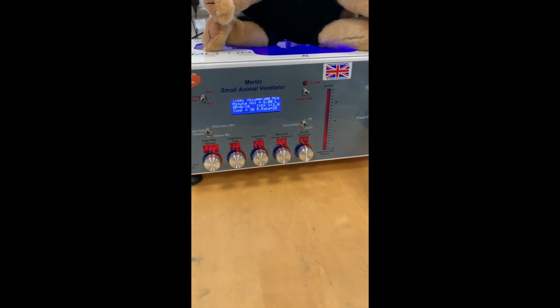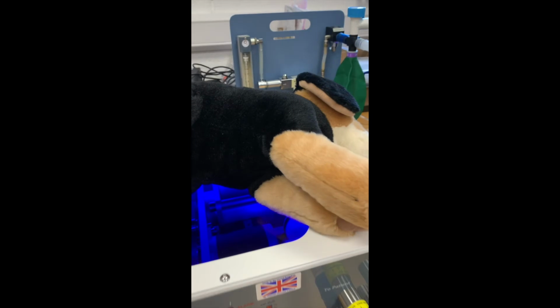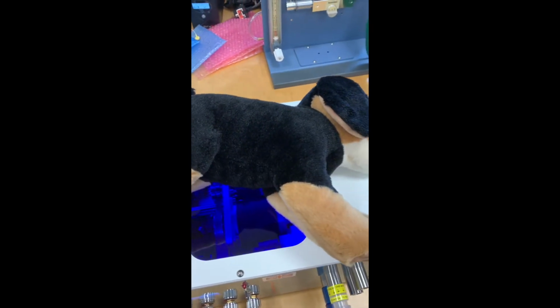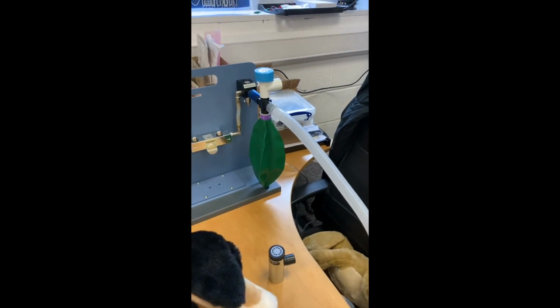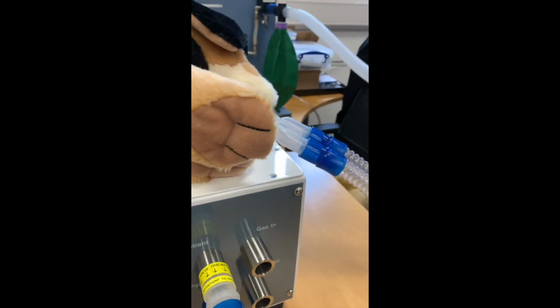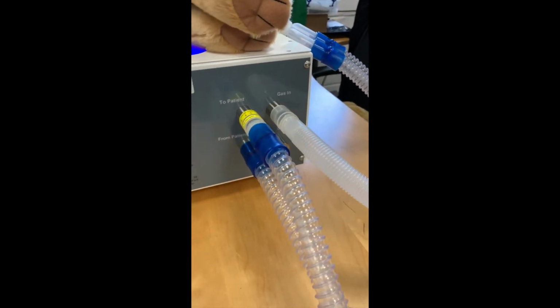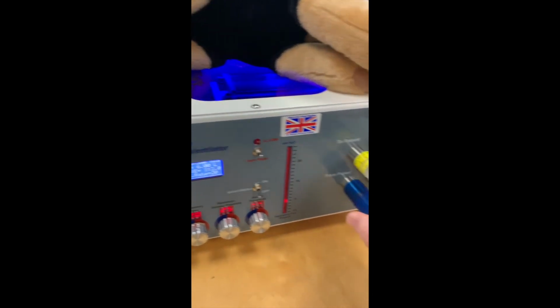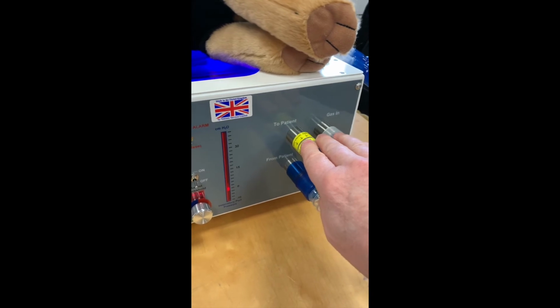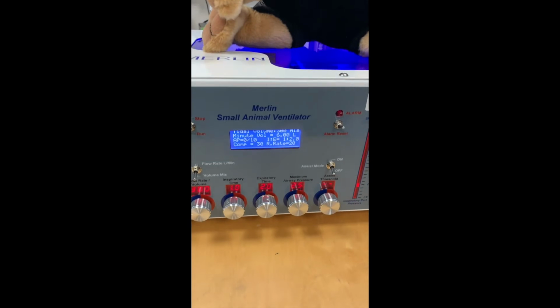Okay, let's set Merlin up for volume cycling and to ventilate a patient for about 300 mils tidal volume. In this instance, our patient here is Rover, an animal simulator which has a lung capacity of about 300 mils. We've been running on a non-rebreathing circuit from an anaesthetic machine with the gas flow fed into the gas in. We haven't got anything on the gas out, but that would be straight to scavenge. For the patient connection, we have to patient and from patient, and we have a one-way valve in the to-patient limb. We'll come back to that later. Okay, to set up for volume cycling is very simple.